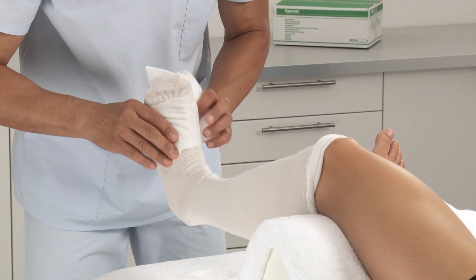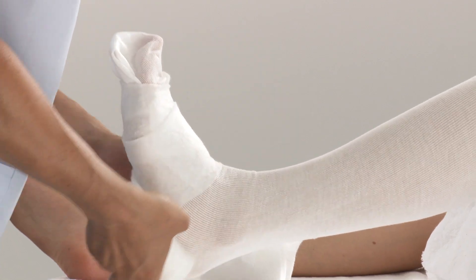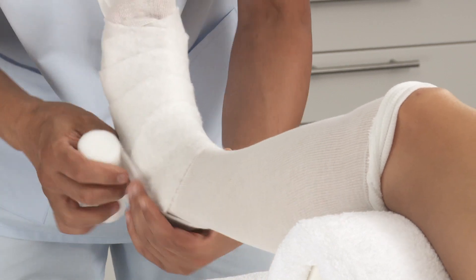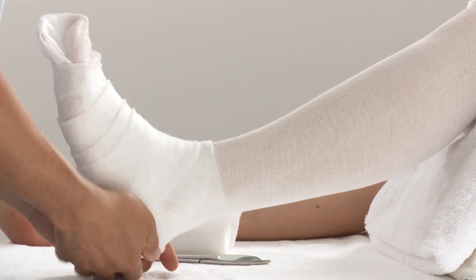Apply padding to the limb by wrapping it from the metatarsals, around the ankle, and up the lower leg, using a second roll of padding if needed. Use extra padding for any bony prominences.